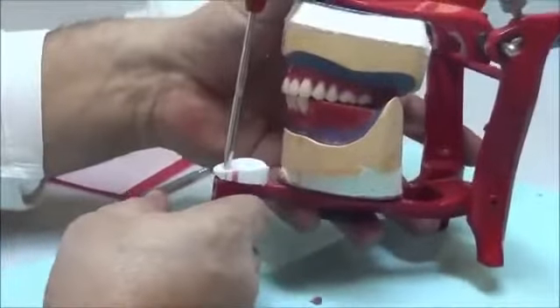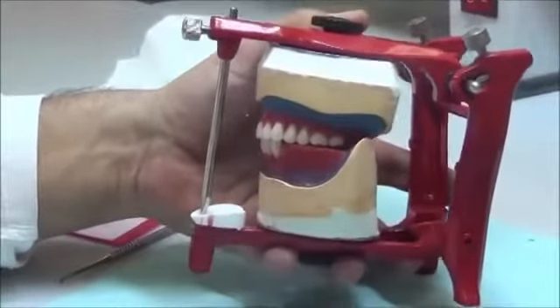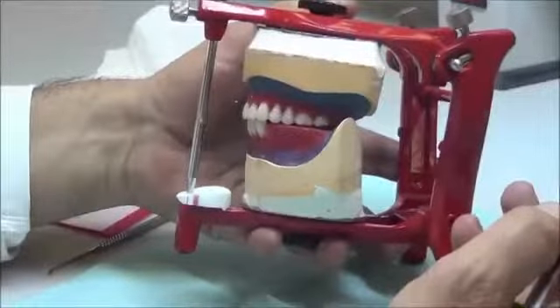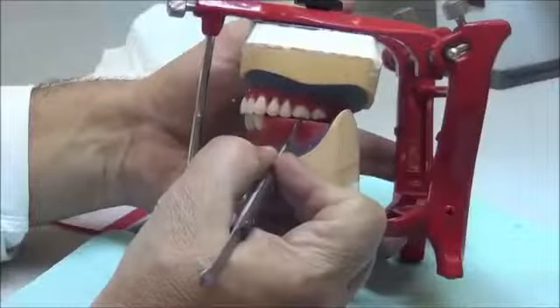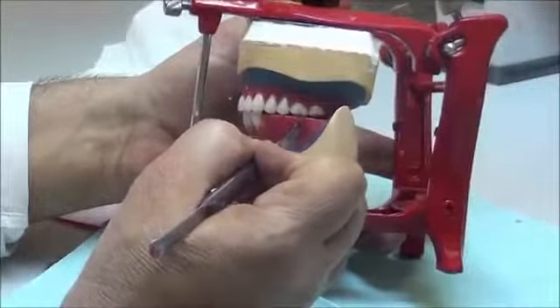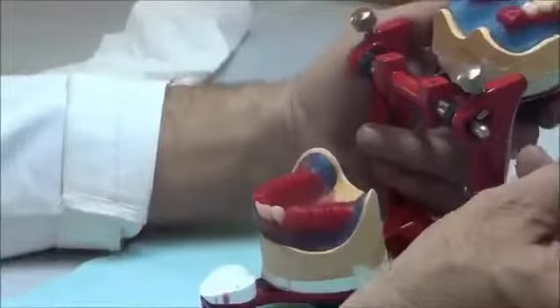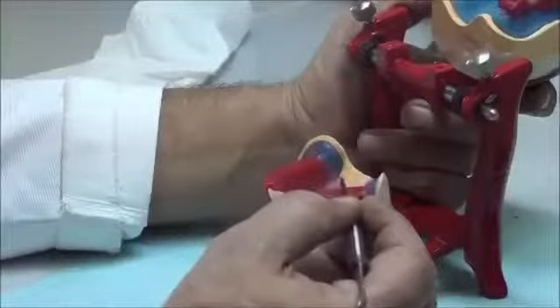Today we're going to talk about setting posterior teeth. After checking the quality for the upper and lower setting, we begin with the first step in adding posterior teeth. We are going to begin with tooth number 6. Tooth number 6, which is the first molar, is the biggest tooth in the arch, and its location is a bit to the mesial, so it's in between the mid of the upper 6 and the distal of the 5.